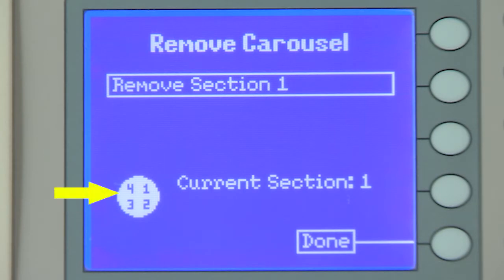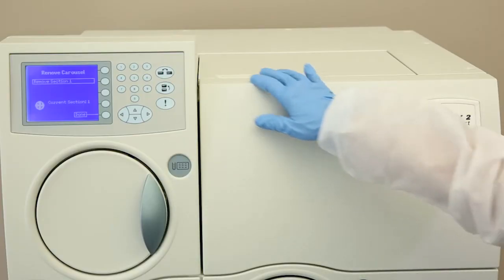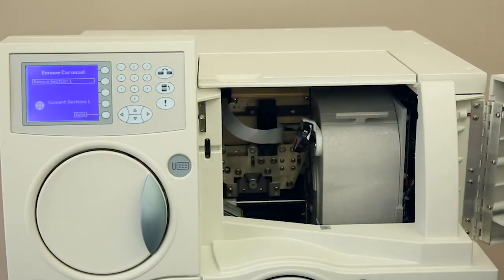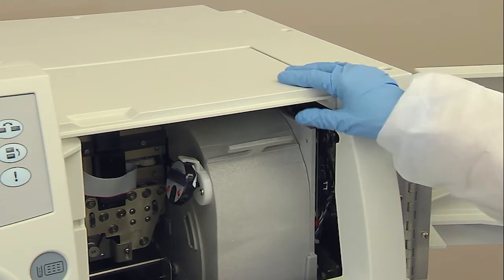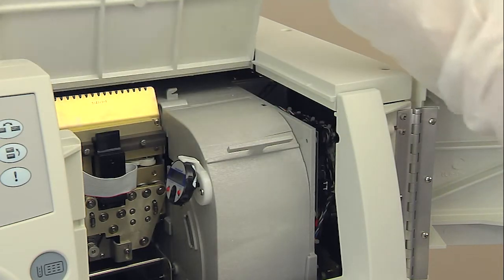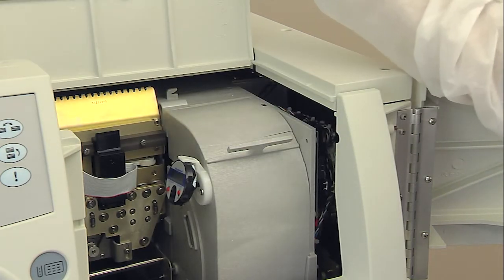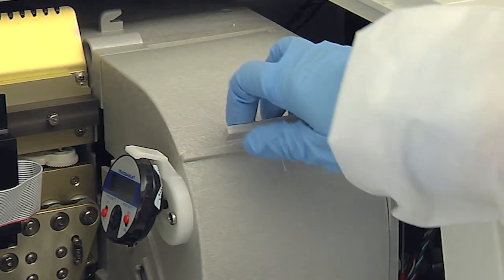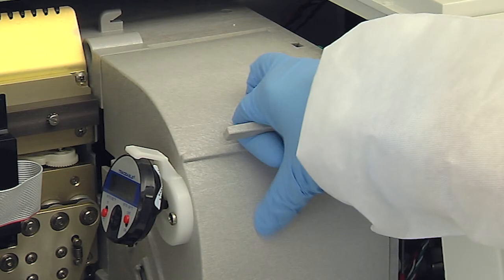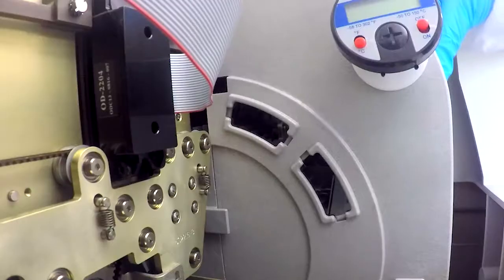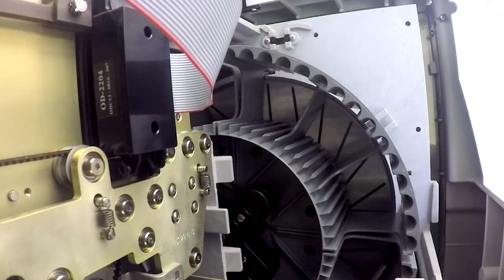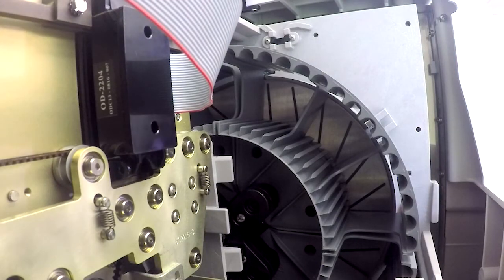An icon on the screen indicates how many sections are in the instrument. Open the front and top user access doors to gain access to the carousel. Next, remove the carousel cover by grasping the handle and lifting the cover straight up from the instrument.